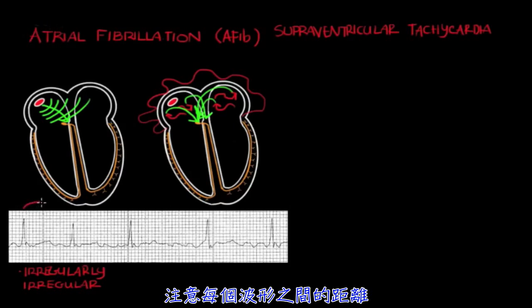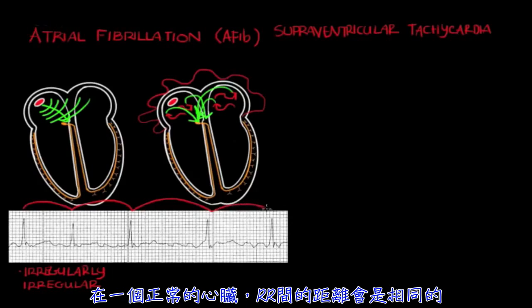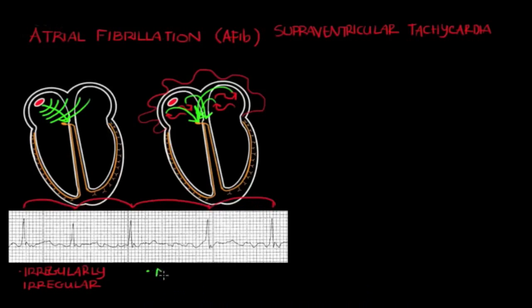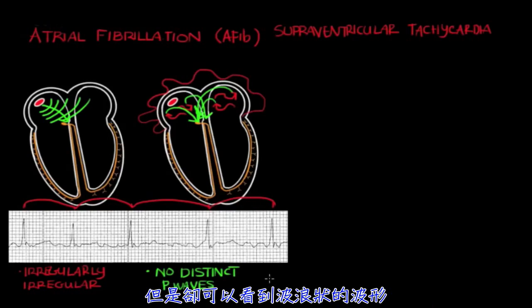What does that mean? Notice how the distance between the R-R intervals is different with each beat. In a normal heart, you'd see evenly spaced R-R intervals. But with AFib, you have different distances between the R-R intervals. Also in AFib, there are no distinct P waves on EKG. Instead, you have these coarse squiggly lines running through.